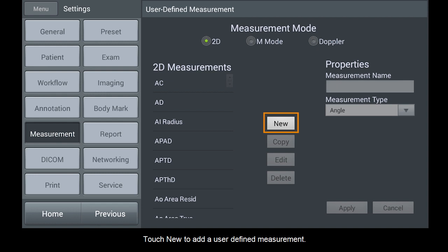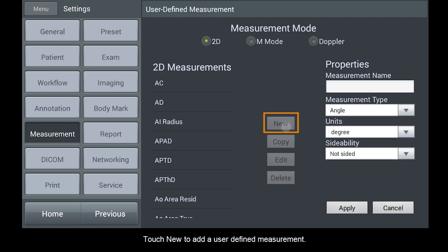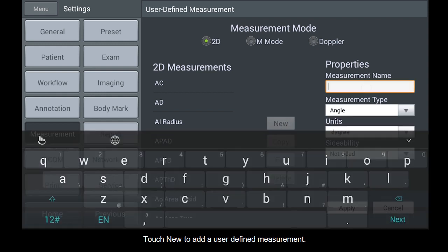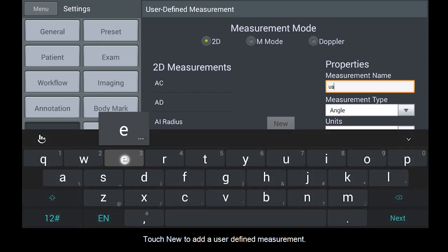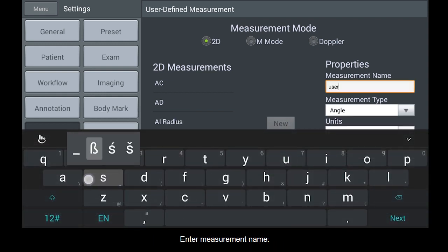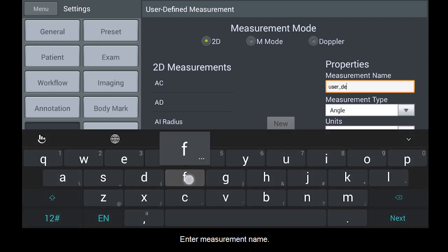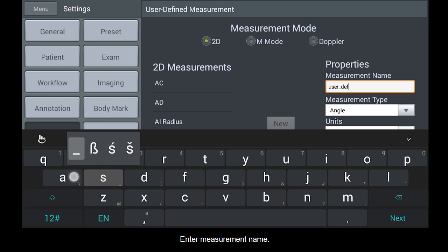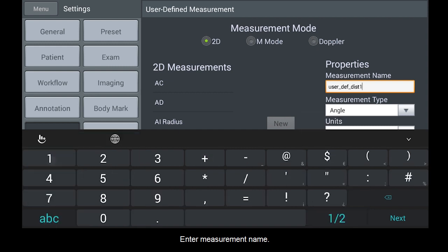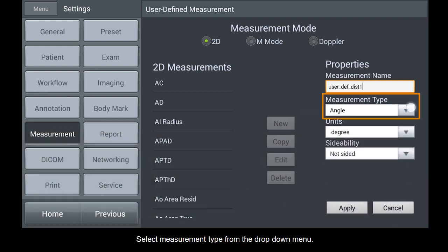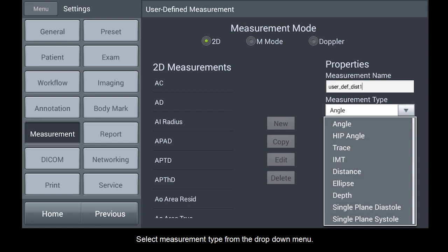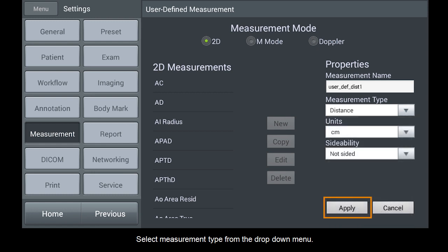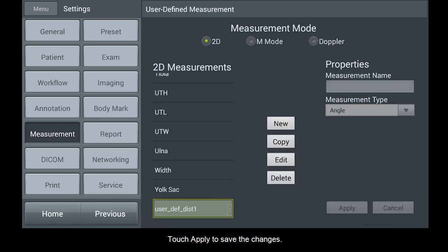Touch New to add a user defined measurement. Enter measurement name. Select Measurement Type from the drop-down menu. Touch Apply to save the changes.